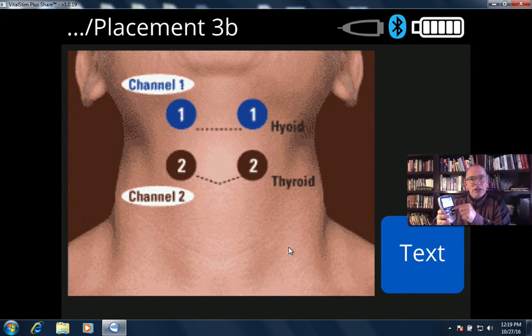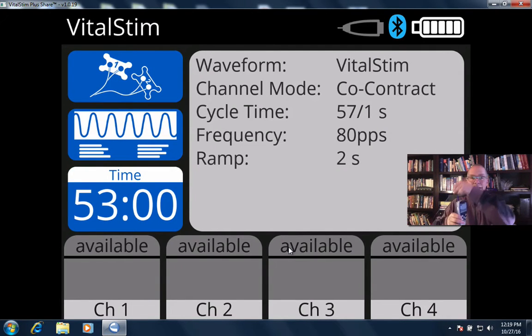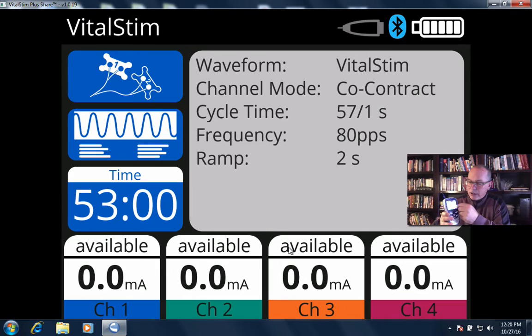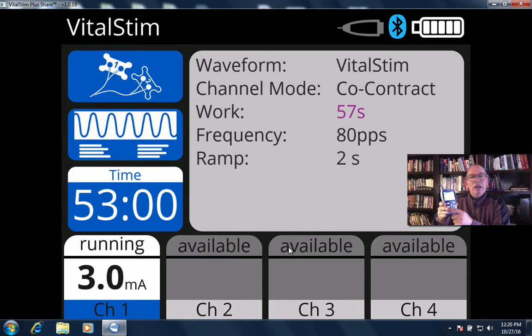Most therapists obviously don't need that. Once you've placed the electrodes on the patient and connected the lead wire to the electrode, all you have to do is select the channels that you're going to be working with. In this instance I'm only going to select one channel, but I could select one, two, three, or four channels as appropriate by just touching them. I then increase the intensity until the patient feels it. Once the patient says they can feel the stimulation, I just leave it and I'm done.